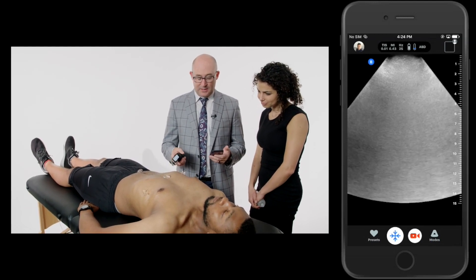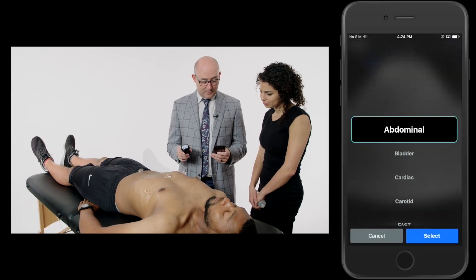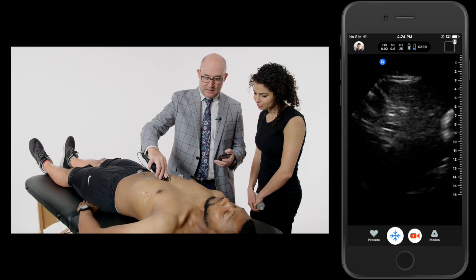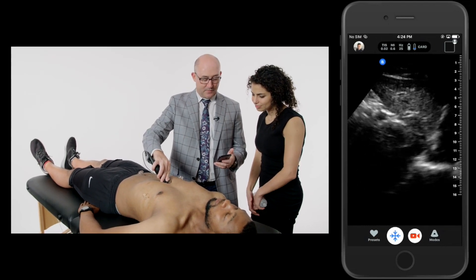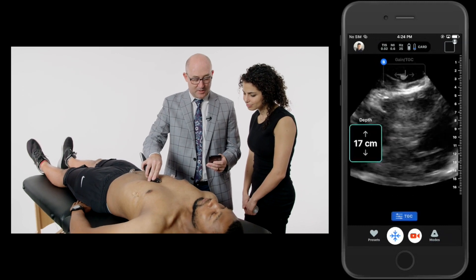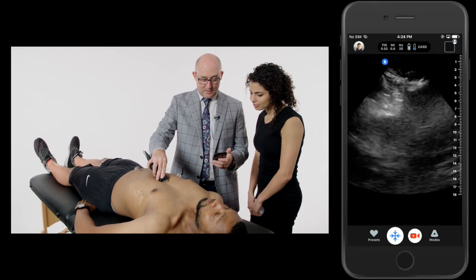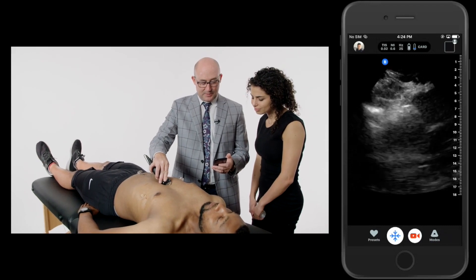I'm going to come over here now and change to cardiac. I'm actually going to do a sub-xiphoid view of his heart. Preset, turn it to cardiac, select. Whenever I do a cardiac sub-xiphoid view, I start with the liver and I just rotate the transducer around. The heart's kind of hanging off the bottom of the screen. I'm going to change my depth so I can see the entire heart, and as he takes a breath, we'll start to see the heart a little bit easier.